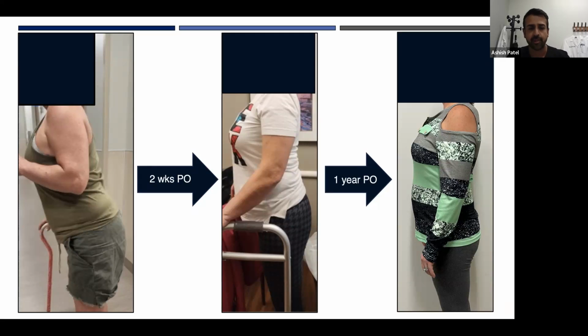But when you talk about 1-level surgery, single position surgery, whether it's a lateral position or in the prone position, really makes a lot of sense for that 1-level degen case. Here, the versatility is like you can mix and match and add it to deformity surgery as well. And even if you think of it at a later stage, or say if things are going well, I'm going to add it. That's a really nice thing to do.